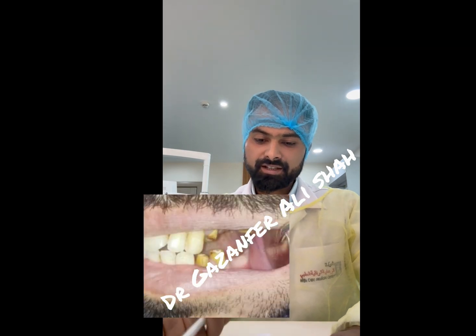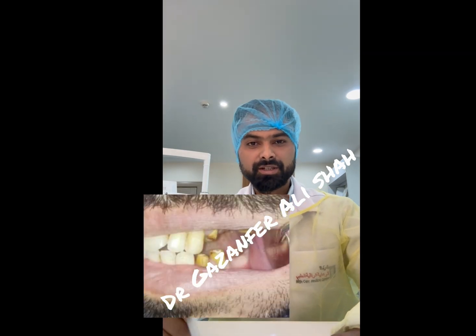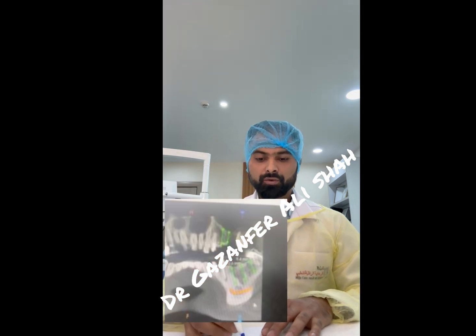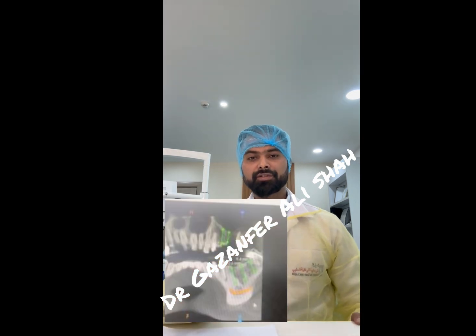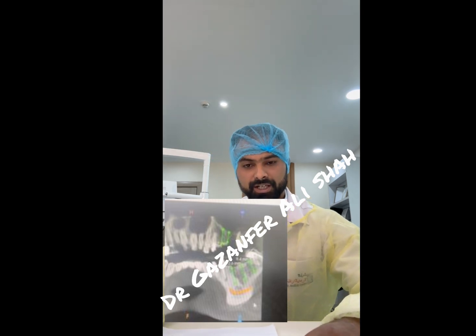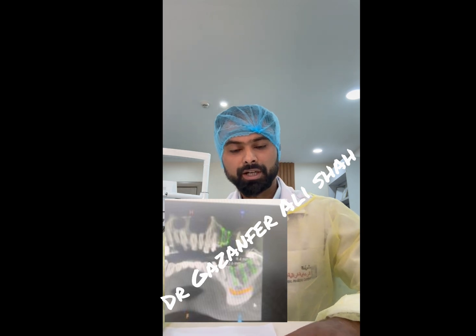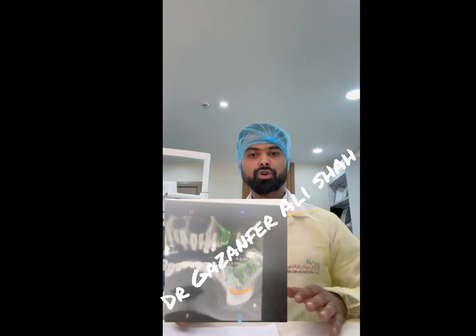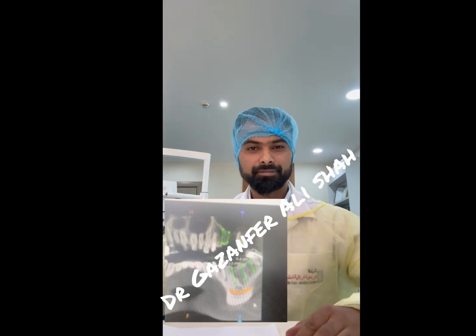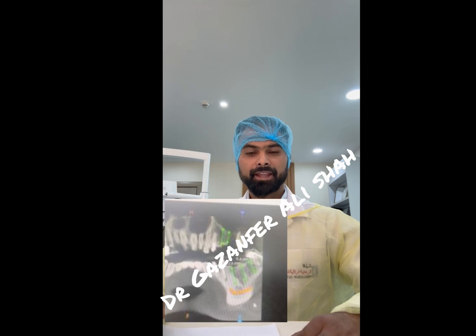As far as this case is concerned, this patient landed in our hospital with the chief complaint of fracture of prosthesis. On clinical examination, there was a periapical lesion in relation to the canine and first premolar. So retreatment was initiated in relation to the same. Calcium hydroxide was placed so that there is resolution of the periapical infection, because there should not be any infection adjacent to the implants, as it would have negative consequences on the long-term implant stability.